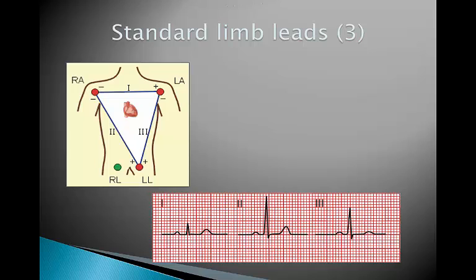All right, so this is just showing you different limb leads and things, so you don't have to remember this, but there's white, black, and red are the 3 leads. Okay, so white on the right, and then smoke over fire. So smoke is the black one, that's on the left arm, and the red one is down on the left leg. Okay, that's how I remember it.